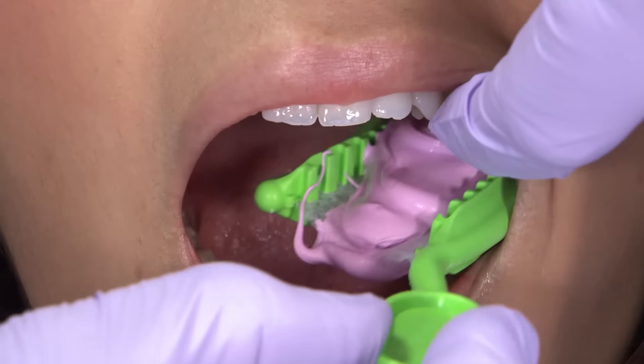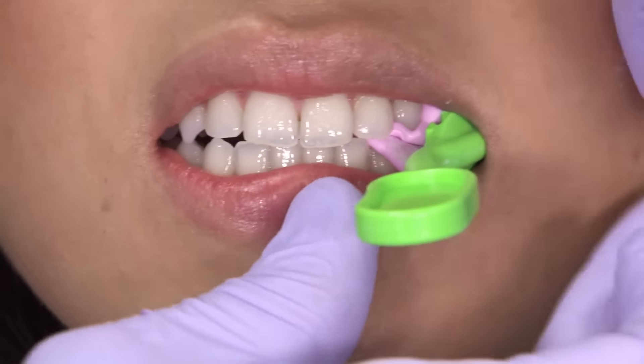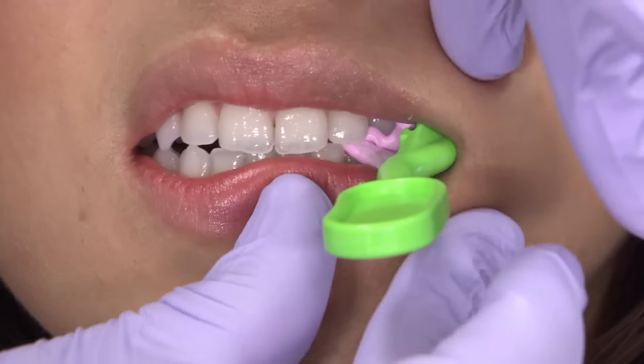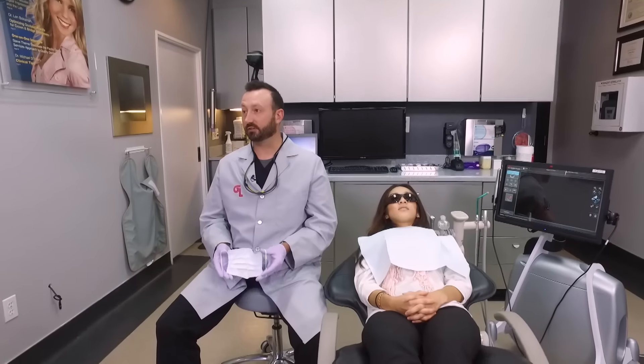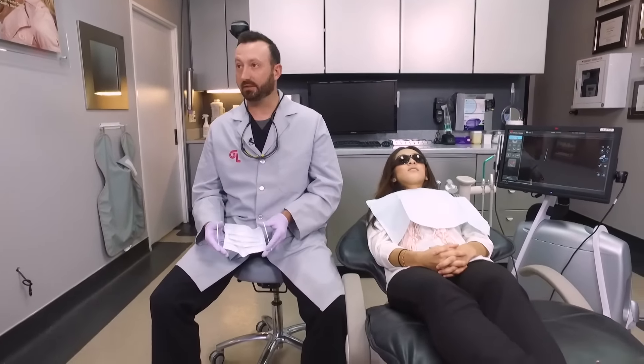The most important thing I can tell you: always, no matter what the situation — whether sending a case to the laboratory or milling chairside — take a pre-impression. You're going to hate yourself if you don't. What I want to teach you today is how to let the doctor go into another room to continue on other patients while you handle the scanning, powdering, milling, and adjustment of the crowns. Of course, only an Expanded Functions Dental Assistant can place, check bite, and adjust contacts. However, as Registered Dental Assistants we can do everything else up until then.